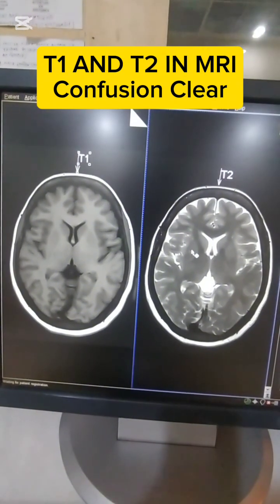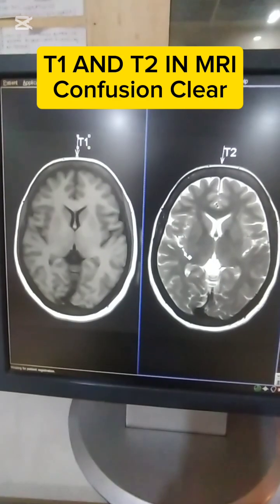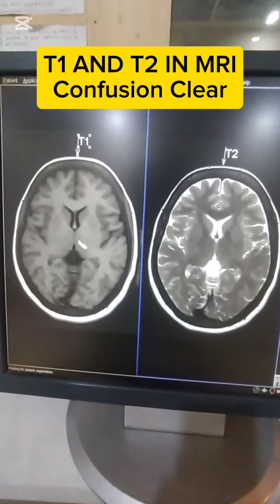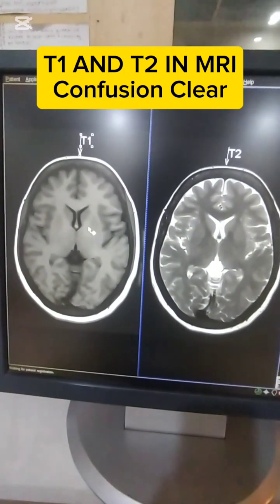And if you compare the two images, the first one is T1 and the second one is T2. Why is this T1?